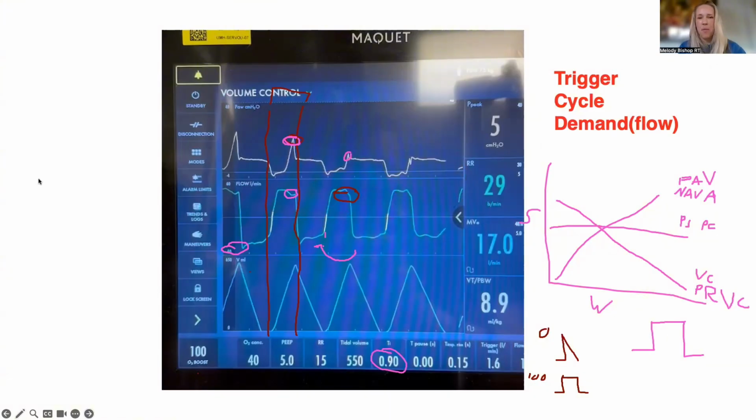100%. Exactly. And that would be alarming. It would be bad. Although the alarm thing is a whole separate issue, honestly. But it's true. So how wide were they set?